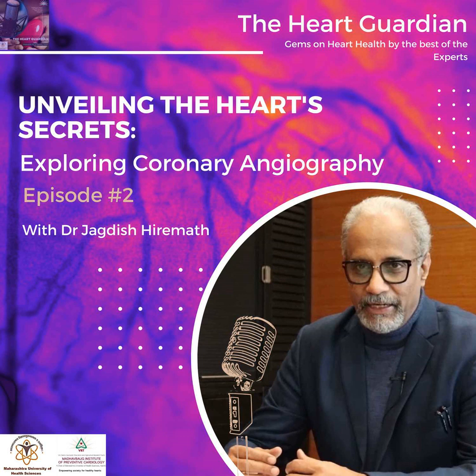Angiography divides the patient into 3 groups. Mild or no disease: it requires only small medication or nothing at all. Few main arteries with more than 75% blockages go for angioplasty or stent implantations. Many arteries blocked and percentage narrowing is more than 75%: a severe disease would go for open heart surgery like a bypass surgery.